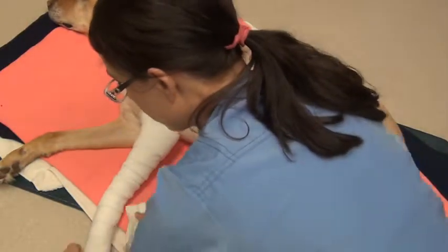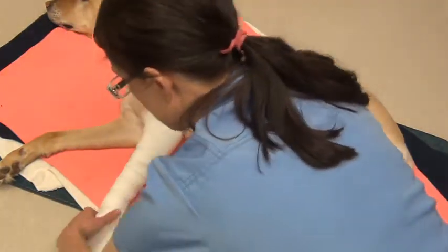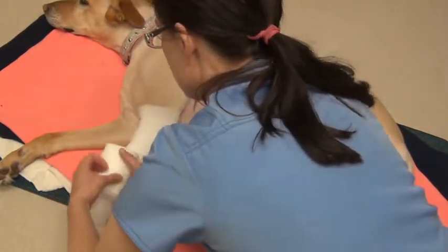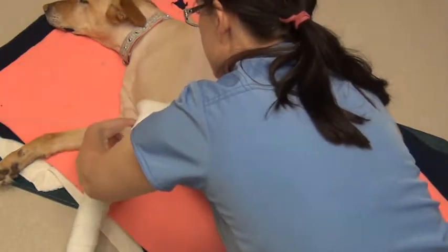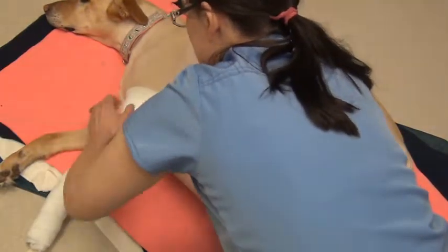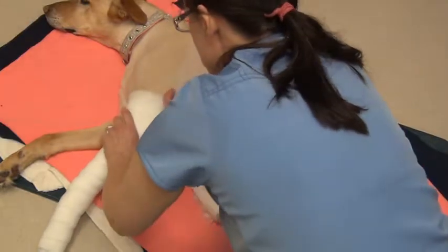I'm going to restart with my second fresh roll to give her an extra layer of padding. Good girl. And I still got my toes sticking out, and I can see my stirrups. They're not as long as I'd like for them to be, but I do have those. Alright, so we're just following the spiral pattern and laying it down on 50% of my previous spiral. She's being a very good patient. Alright, I'm just going to give some extra cushion around this elbow and up into the axillary region. We don't make this too big. Alright, what a good girl. You can tear this or you can cut this when you need to detach a piece.